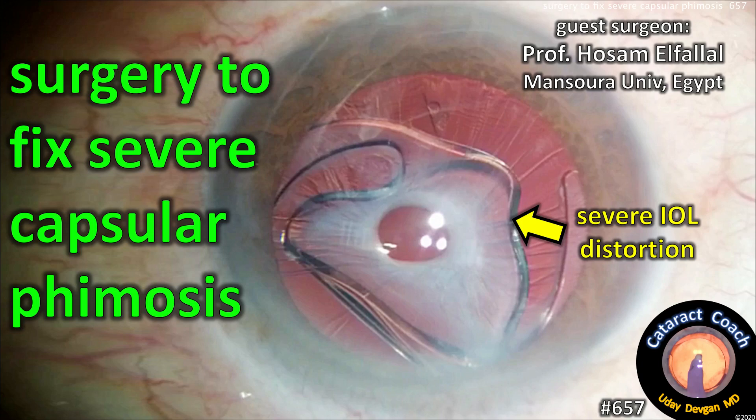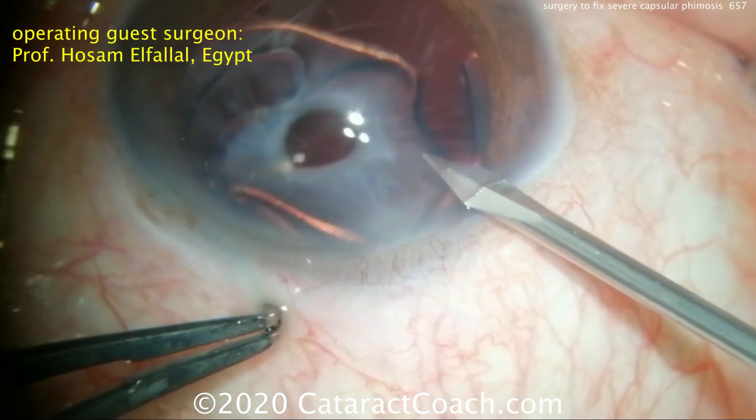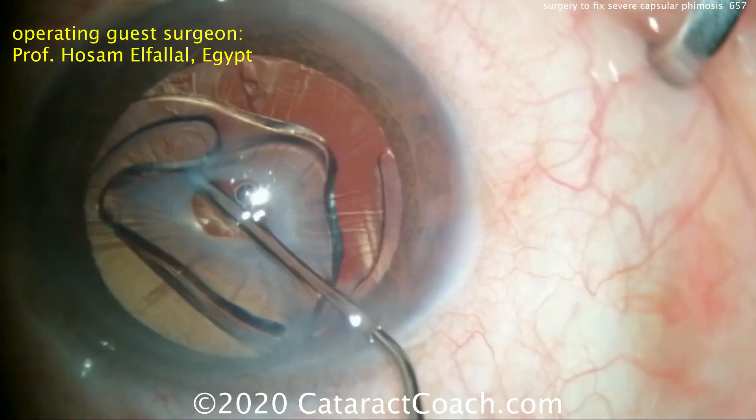CataractCoach.com presents surgery to fix severe capsular phimosis from Professor Hossam El-Falal of Mansoura University in Egypt. You can see the stretched zonular support, the severe phimosis of the anterior capsular rim, and look how distorted the IOL optic is — it doesn't even look round.